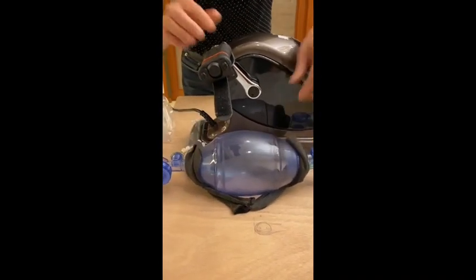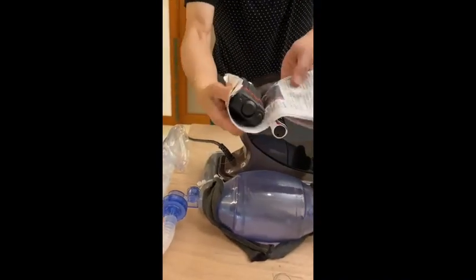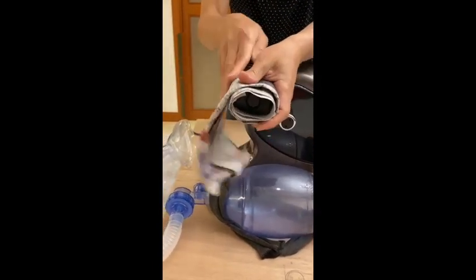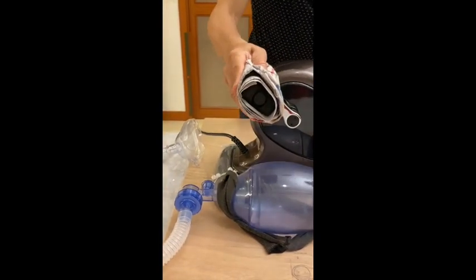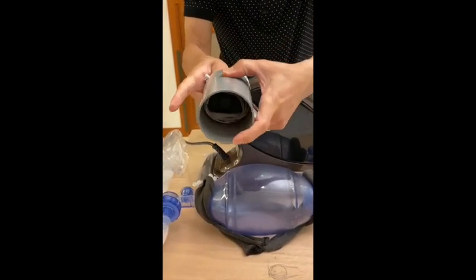So now let me show you the pedal assembly. We wrap the newspaper around the pedal, and then insert a two and a half inch PVC pipe to make the pedal round.